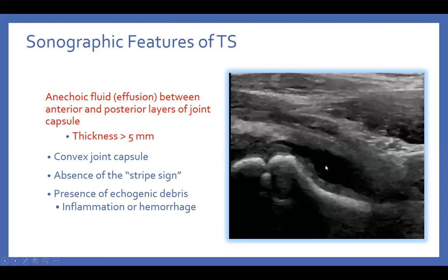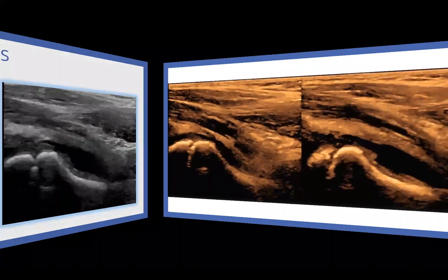In this situation, there is an effusion. It is transient synovitis, but there's one thing missing. If I want to prove there's something going on, I told you earlier, you need to compare it to the contralateral side. Even if you take a picture like this, it can be convincing, but to be more convincing, remember that you look at the other side. This is exactly what we want to do: compare.